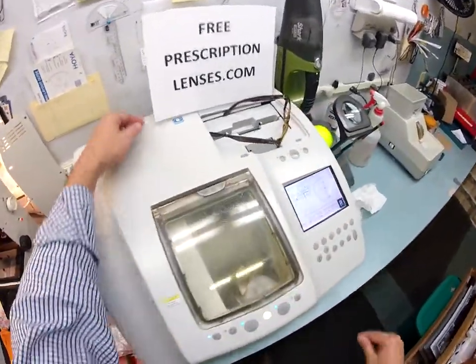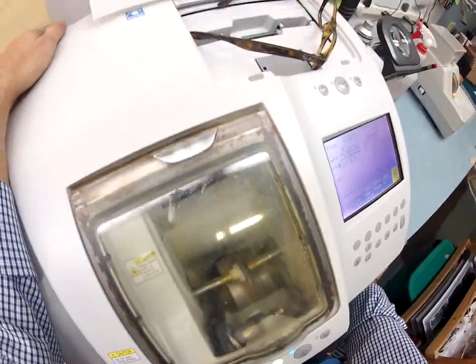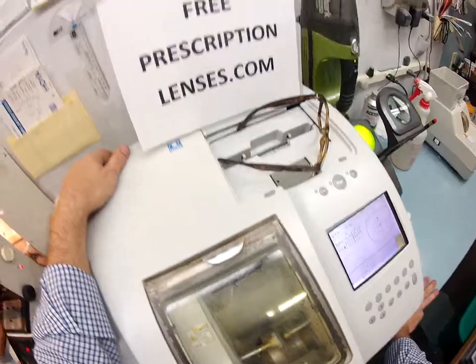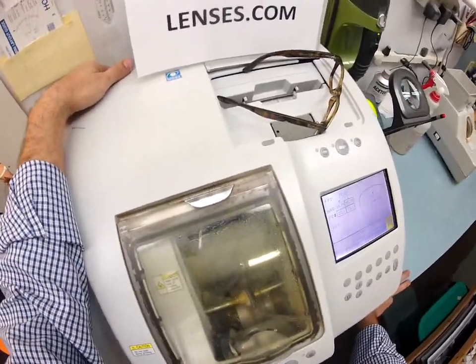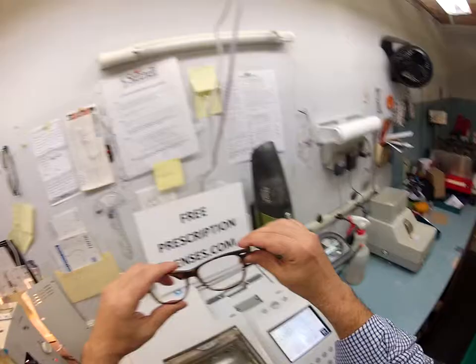So, hopefully you can see through there. Let me see if I can clean that window a little bit. And you can see that in there. Now, I'm going to make sure the frame is in standard alignment before I ship it to you, meaning that it's level on the table and there's no wobble. But 99% of all optical shops do free adjustments. So the next time you're near one, just if these are sitting too loose or too tight, or if one side is higher than the other, which mine are.